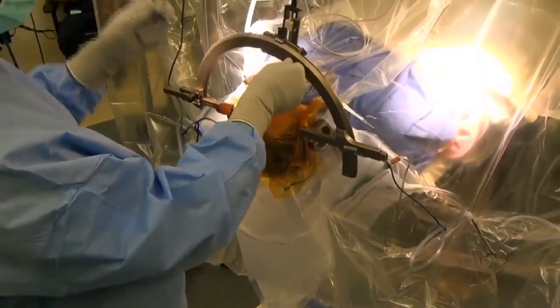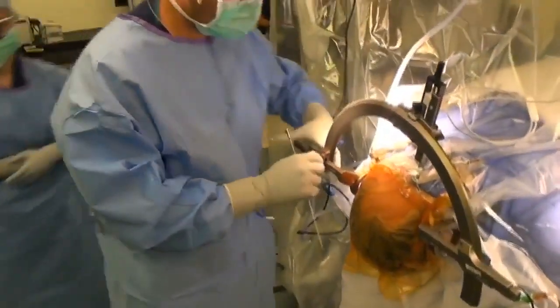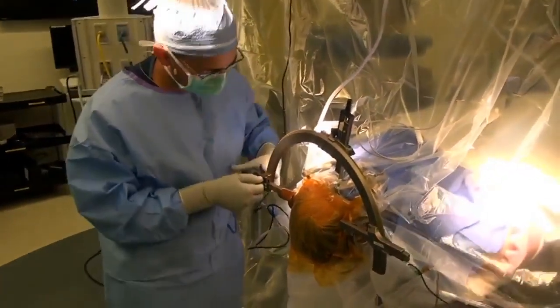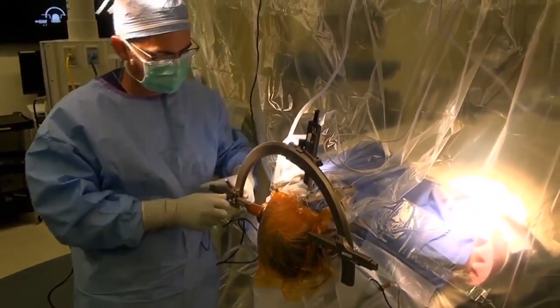Okay. Looks pretty good there. Let's see. Okay, here you go. Specimen cup. Yep, looks good.